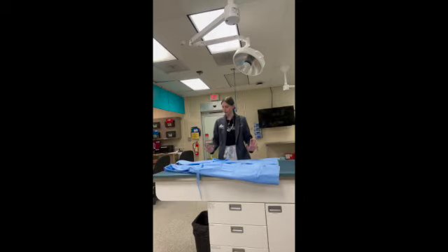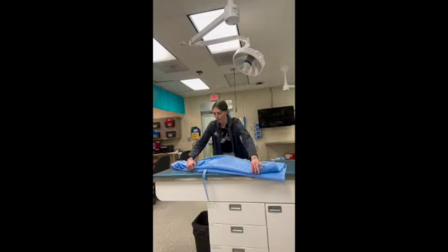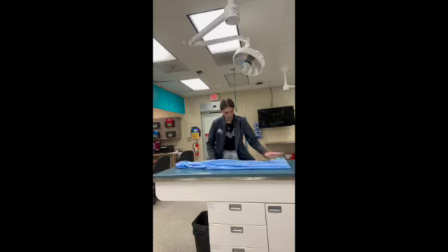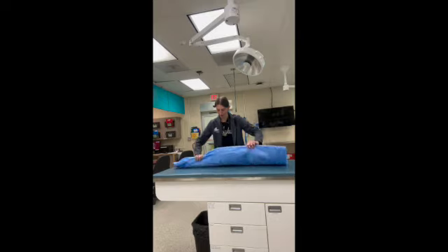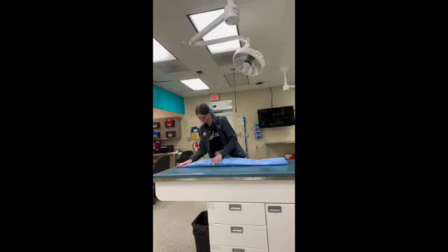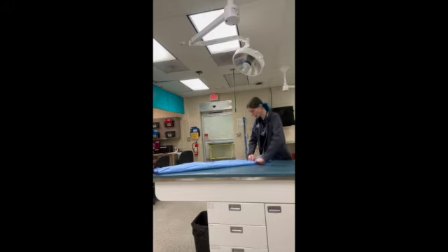Alright, so now that they're both folded about halfway, I'm now just going to completely fold it in half. Alright, and then we're going to fold it in half again. I'm going to start accordioning the bottom of the gown.